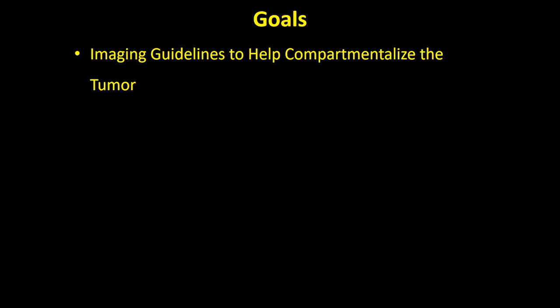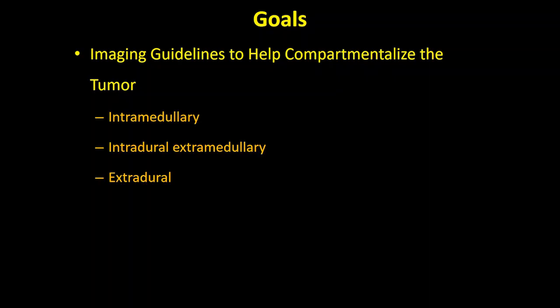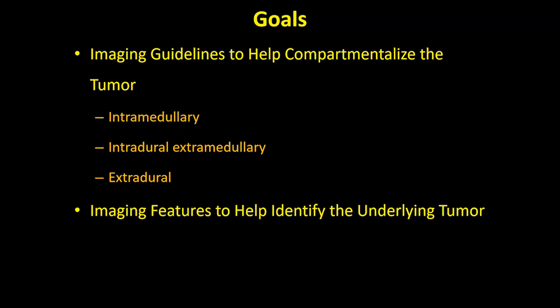So the goals of my talk today will be to provide you with imaging guidelines to help compartmentalize the spine tumor as to whether it is intramedullary, intradural, extramedullary, or extradural in location, and to discuss imaging features to help identify the underlying tumor.